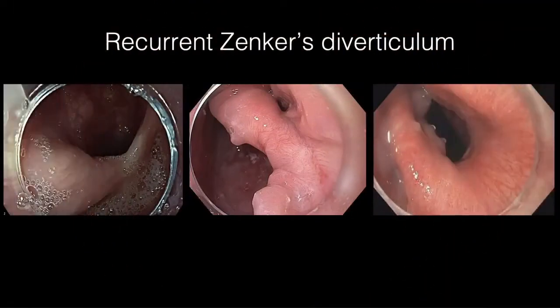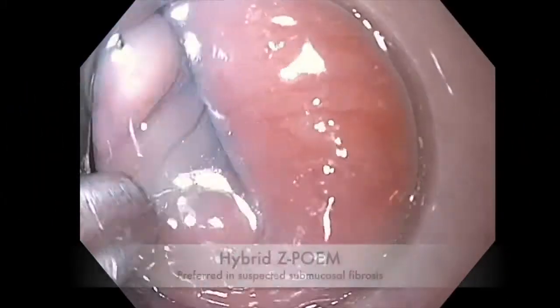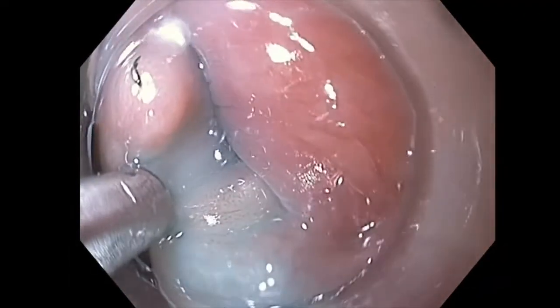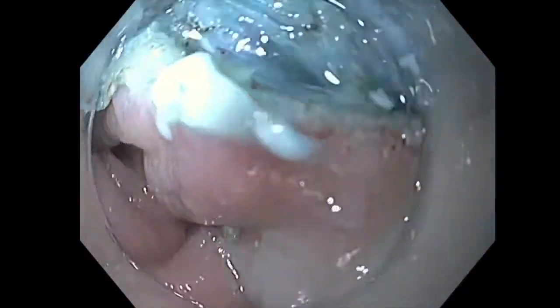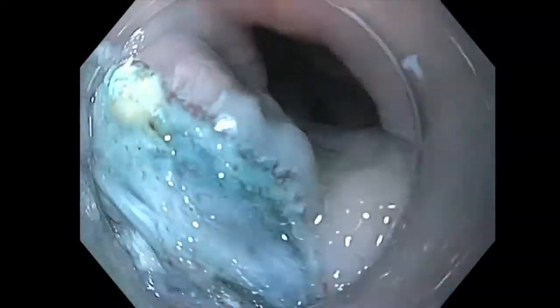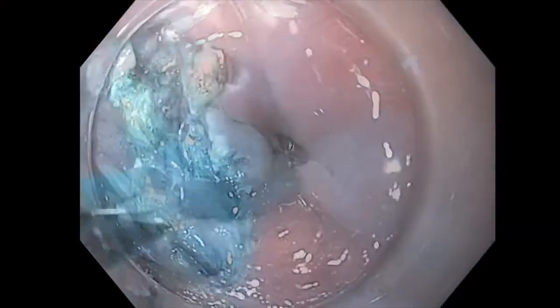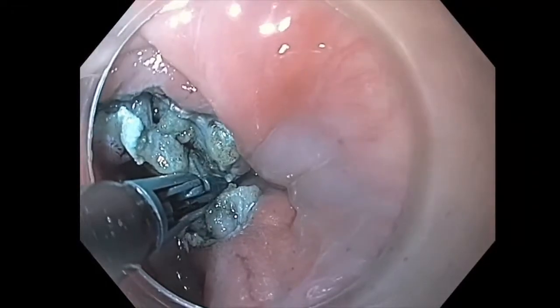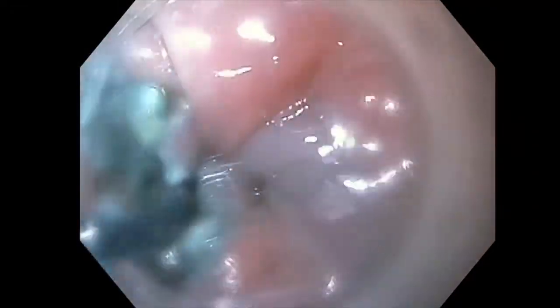Recurrence of Zenker's after treatment is not uncommon, and patients are increasingly presenting after prior surgical or endoscopic therapy. In this case, a surgical staple is seen, indicative of prior treatment. Submucosal injection results in minimal lift. Following mucosal incision, the submucosal plane was not readily identifiable, despite repeated injection of the premixed normal saline and indigo carmine solution. A decision is made to commence standard septotomy.